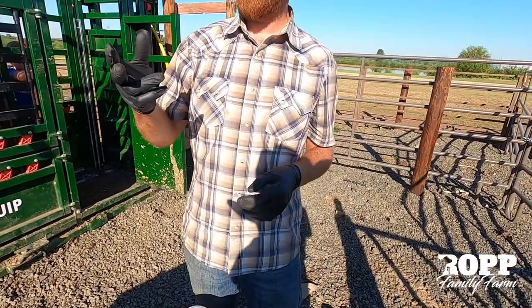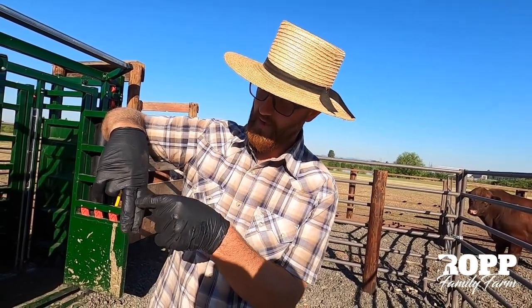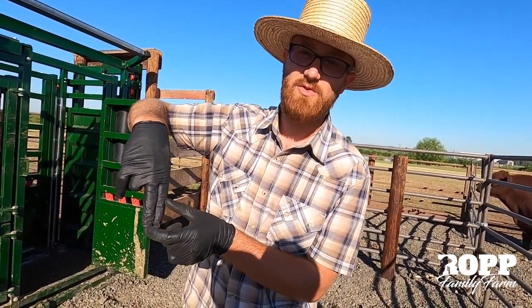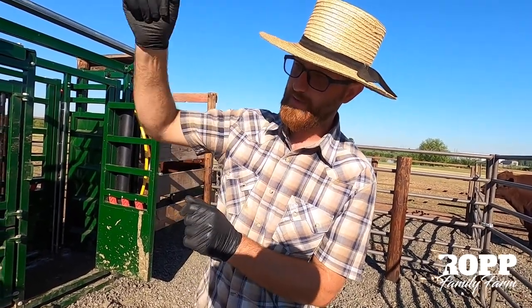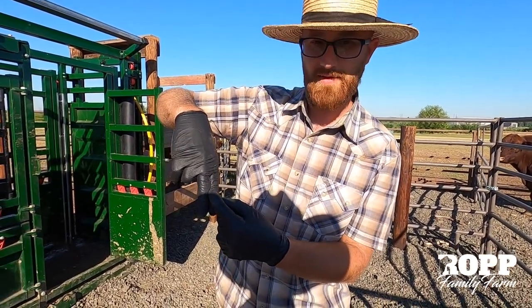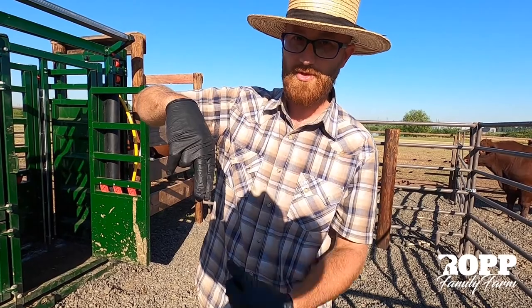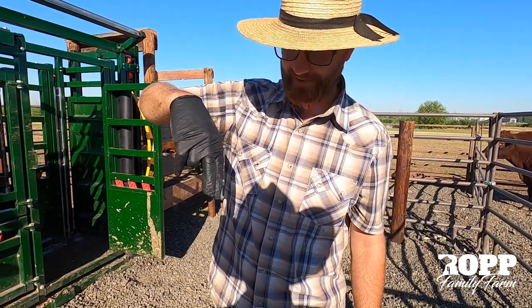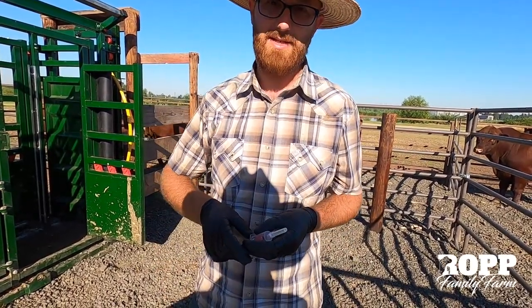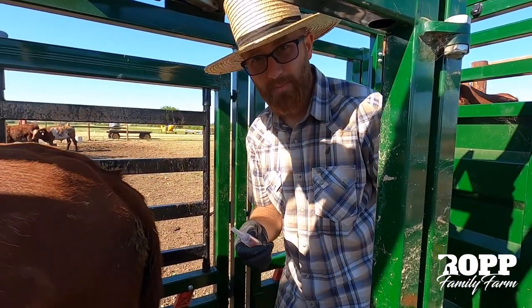If you look on a cow when you fold their tail up, there's a vertebrae in there and then a nice channel where there's a main vein and artery. We're going to go right into that — about two and a half to three inches from the base of the tail head once we have it held up — and go in at a 90-degree angle. If you hit bone you've gone too far. You should see a little bit of blood, then push the vacuum tube in and draw at least two cc's, which is what BioPrint requires to confirm pregnancy.